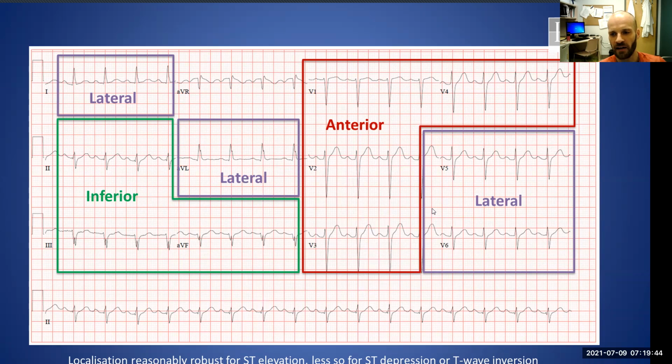So it's not that there's a priority of things. When you're interpreting an ECG, as we go on through the weeks, we're building things up from the most simple to the more complex. But you end up with a description that's not necessarily going to be a 3-word description. It might be a 5-line description: this is a sinus bradycardia; in these leads, I can see this; in these leads, I can see this; overall, this is consistent with a particular diagnosis. So it's not that some leads have more priority than others. You've got to look at the whole lot and take it all into context.